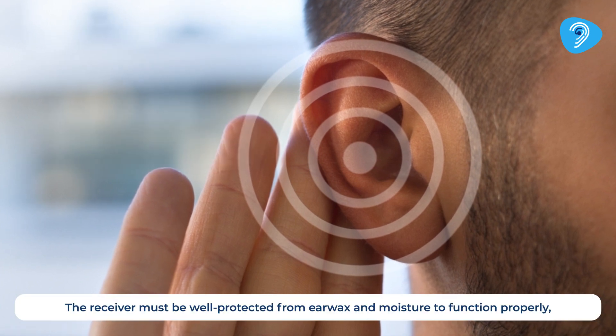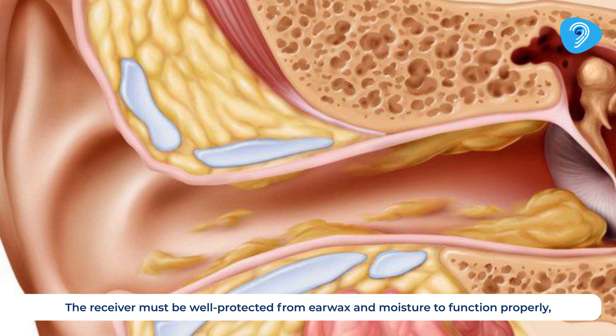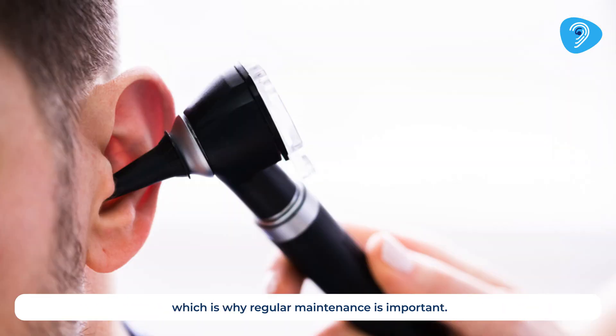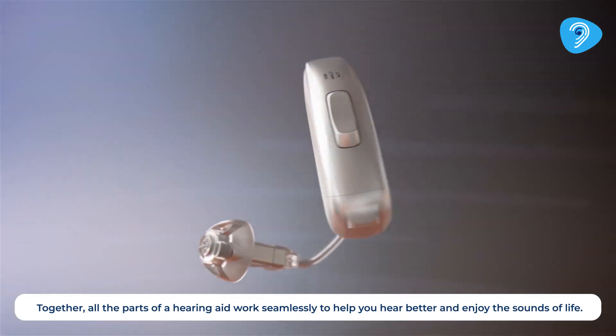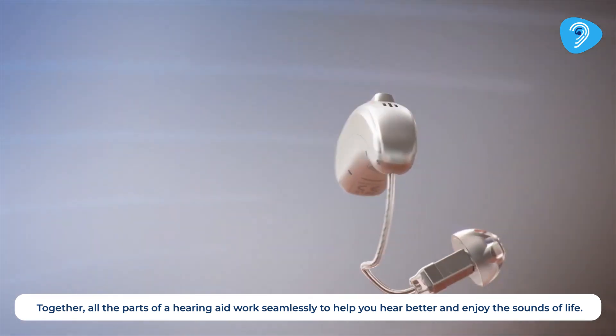The receiver must be well protected from earwax and moisture to function properly, which is why regular maintenance is important. Together, all the parts of a hearing aid work seamlessly to help you hear better and enjoy the sounds of life.